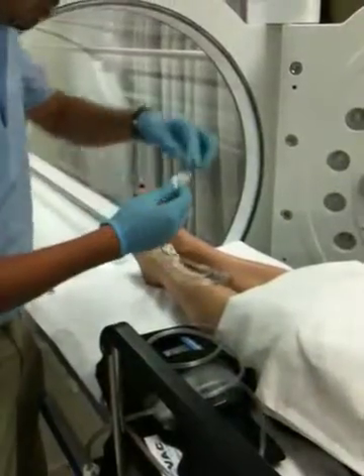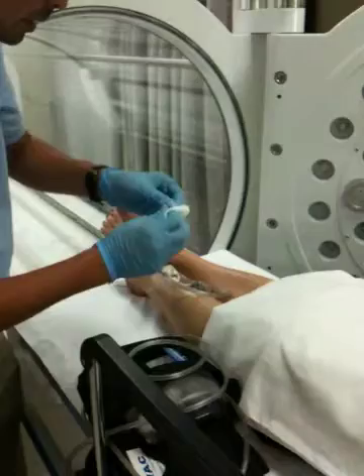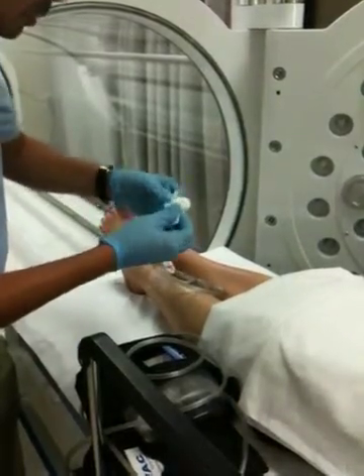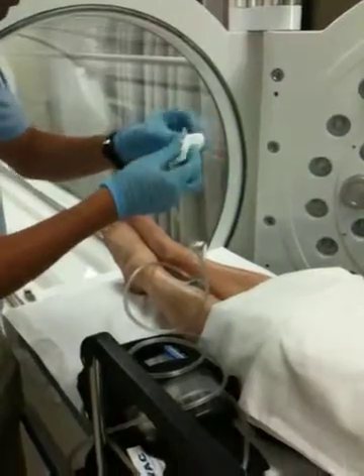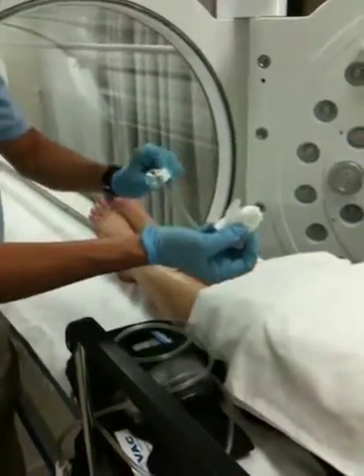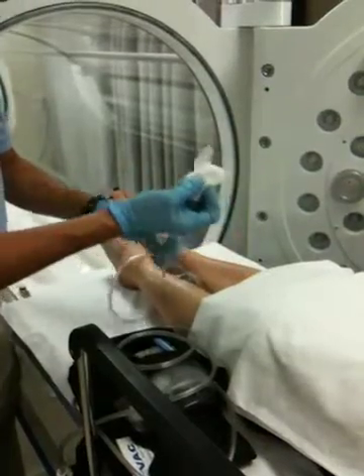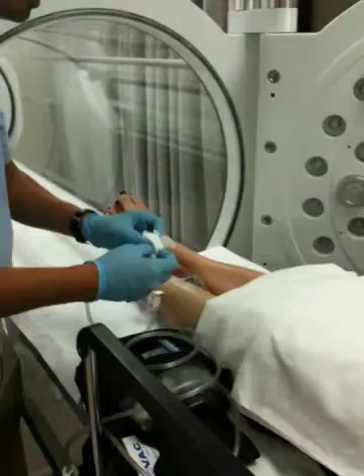We're going to remove the tape and the 4x4. Don't use scissors — you may cut the tubing. Then you're going to have the nurse replace the wound vac dressing. You can clamp this just so that you can have some pressure in there so that it won't leak out while you're reconnecting.